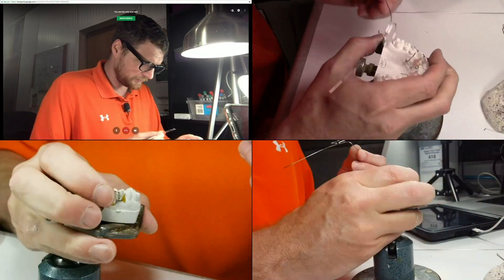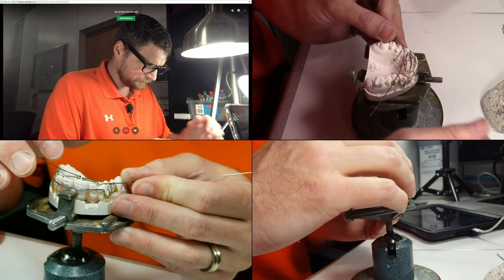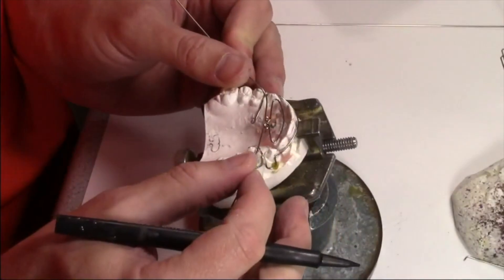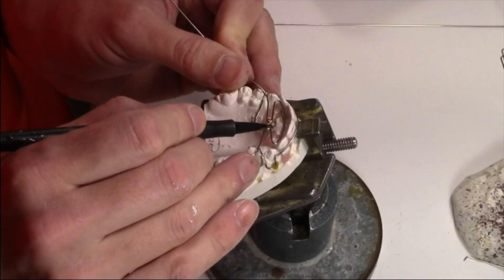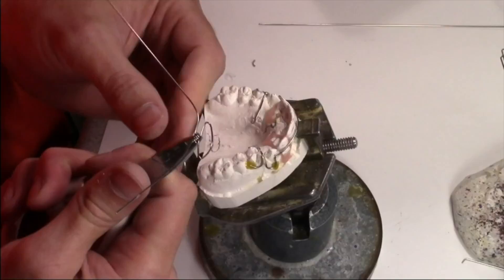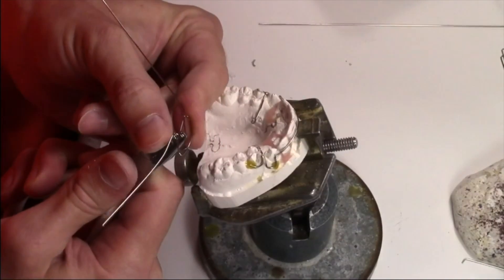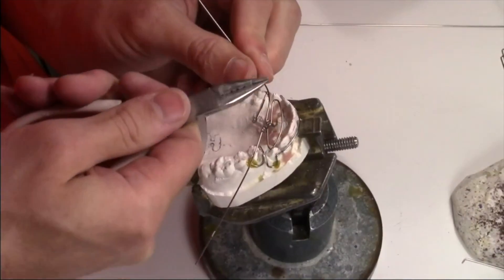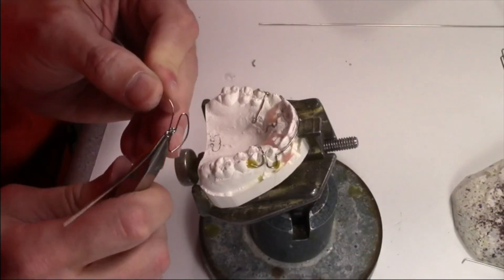I'm going to put this back on the model. Now I need to bend these down into the palate. I think this might be a little longer than that side. To fix that, I'm going to grip the whole thing and bend here — so now it angles up, and then I'm going to grip the whole thing and bend it back down.